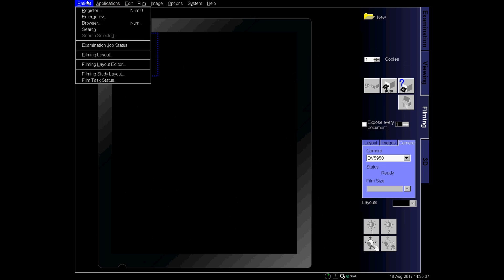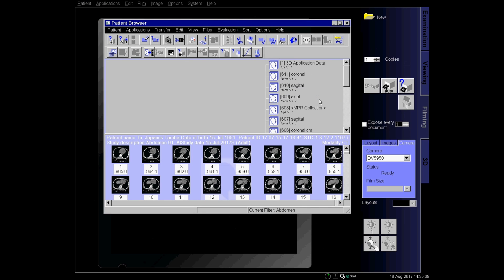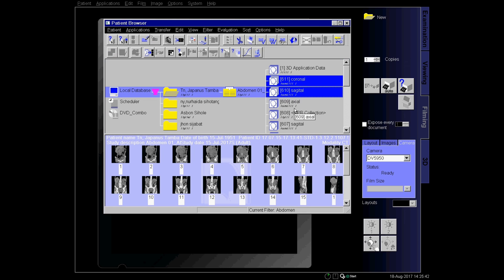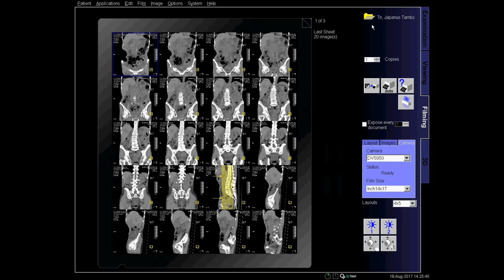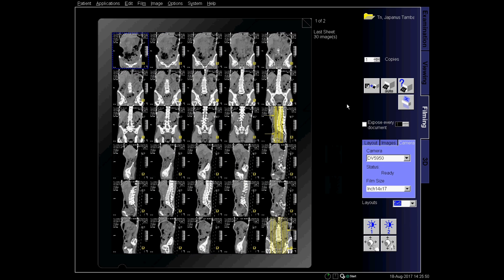Then close it and enter the filming menu. Search for the patient name and data which we want to put into filming and then print later. Then set the size on the layout — as seen in the video, for example 5 times 6.